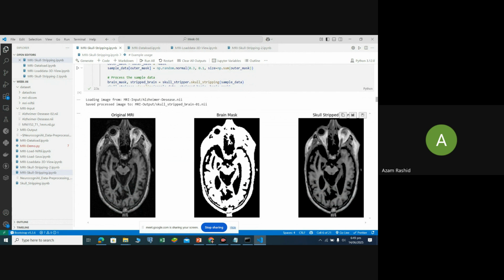We give a mask of a slice, and after slicing you see that it is purely segmented into gray matter, white matter and the blackish area. After applying Grad-CAM and explanation methods, we also colorize the tissue segmentation. This is basically the skull stripping way.